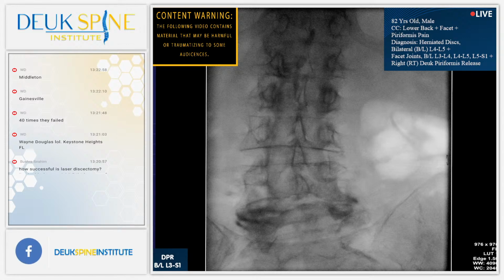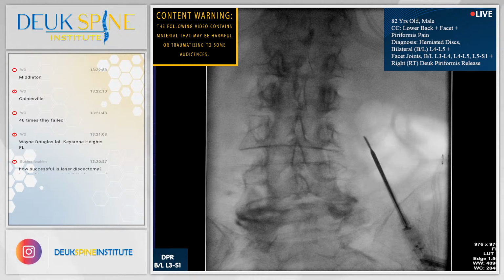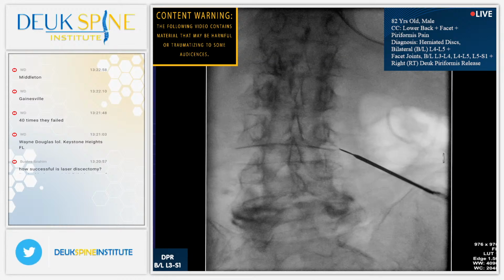Now, the major cause of chronic back pain is the disc, and this patient definitely has disc pain. We just fixed his L4-5 disc shot. Not bad, huh, Jordan? So you think that's 3? Yes. I agree. Yeah, I just need to go more medial. This patient has disc pain. We just fixed it at L4-5, and you can check out our YouTube video a little earlier and see.